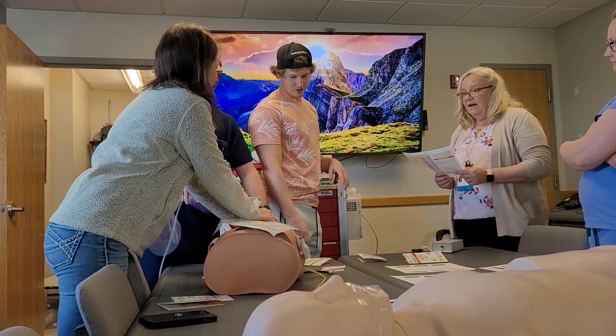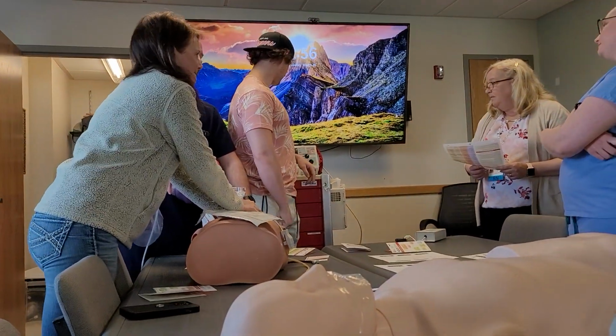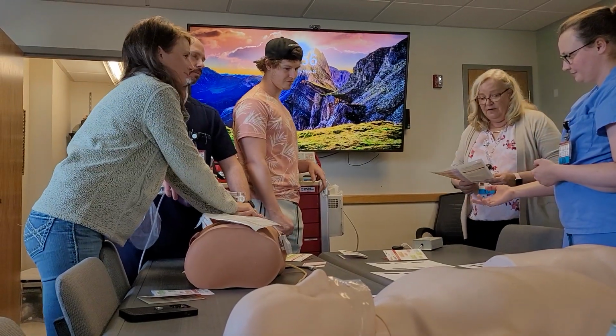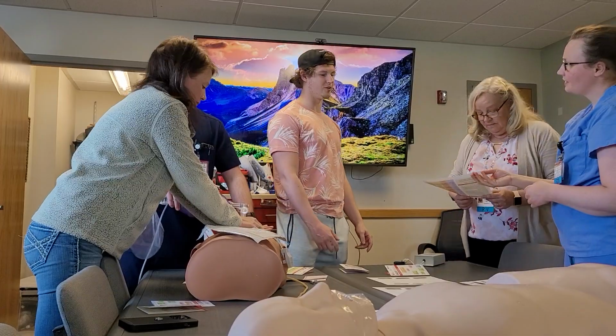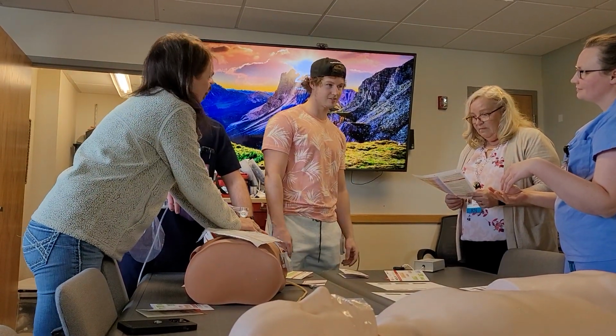Reanalyze. Check the pulse. Okay. So any other medications that we wanna give this person now? Epinephrine, if this continues. How much epinephrine do you wanna give? 1 milligram, please. Get ready. 1 milligram, and ready for the next analysis after 2 minutes. Okay.